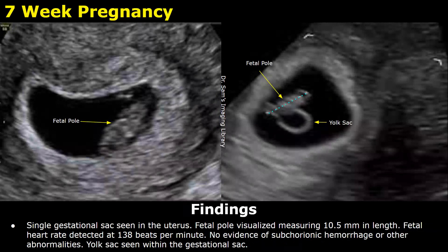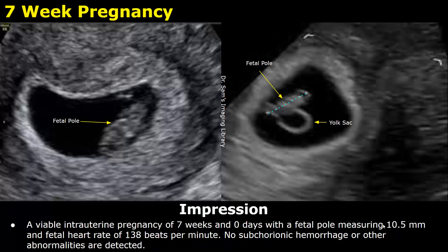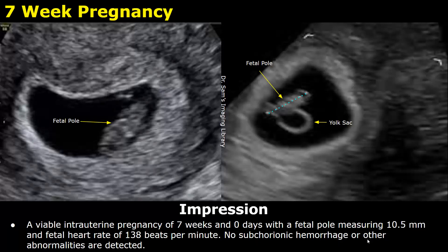Here is a 7-week pregnancy. In the findings, you can write the single gestational sac seen in the uterus, then the size of the fetal pole or embryo, and then you can write the fetal heart rate, which in this case was 138 beats per minute, and there was no evidence of subchorionic hemorrhage or other abnormalities. The yolk sac is seen within the gestational sac. The impression: a viable intrauterine pregnancy of 7 weeks and 0 days with a fetal pole measuring 10.5 millimeters and a fetal heart rate of 138 beats per minute. No subchorionic hemorrhage or other abnormalities are detected.